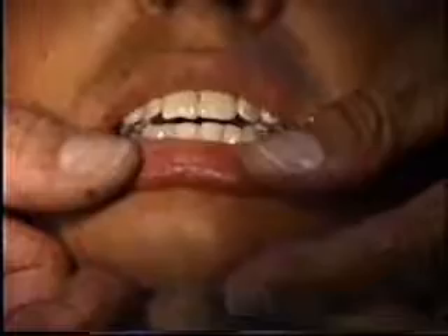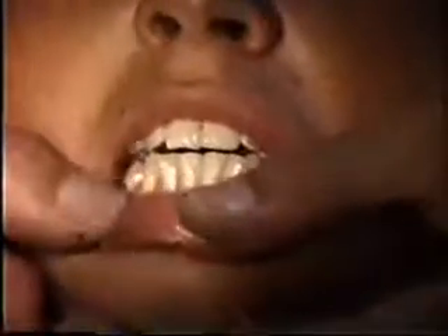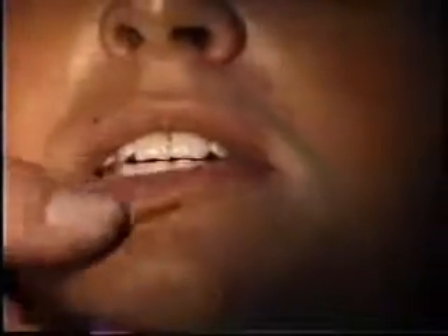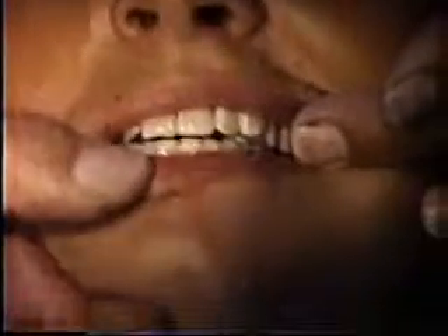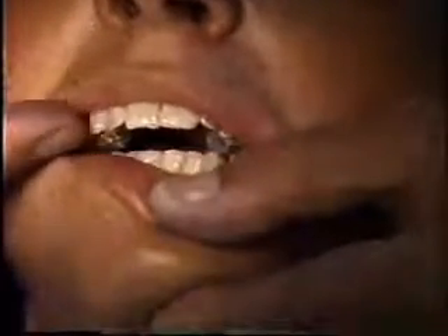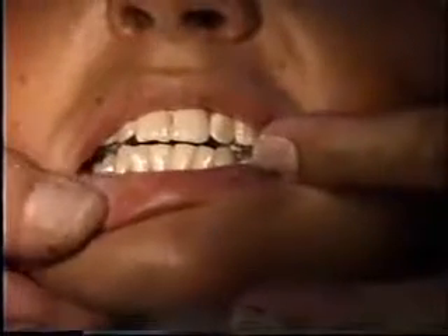Now close again. We're still giving the same relationship of the bite. Does that feel about the same to you now? Open and close a few times. As she does this, she will have to reestablish some proprioceptive activity in the muscles, because it's like a new bite. Tap up and down again. The only problem may come at night when the jaw slides open wide and it may go back, and then she may tend to lock up on the back. If that's the case, oftentimes we have to replace the incline.